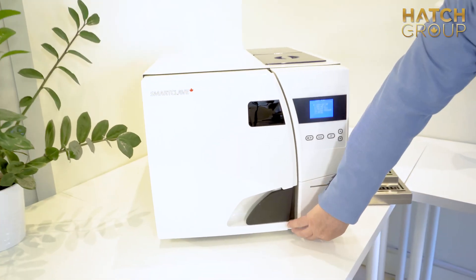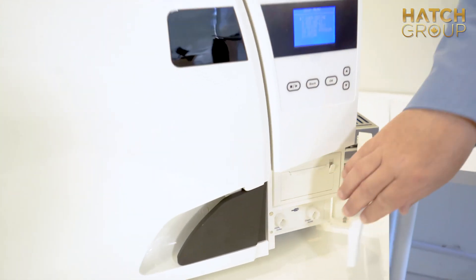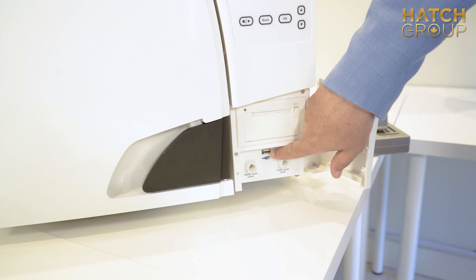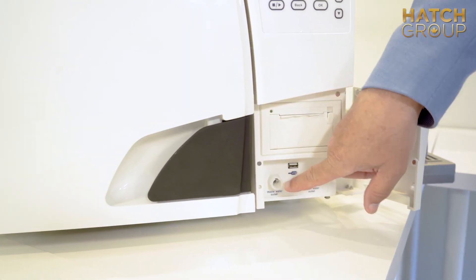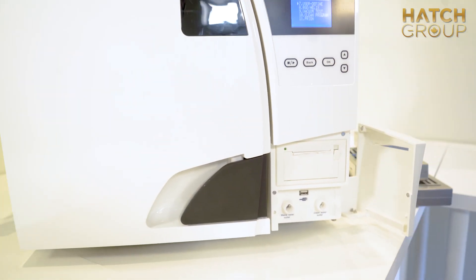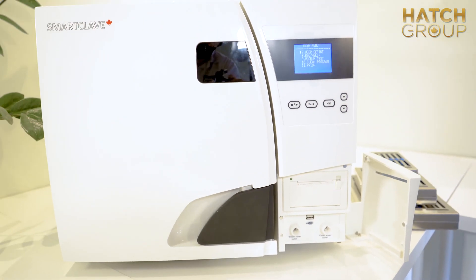Another great feature is it's got a built-in USB and printer. As you can see, you've got the printer here, you've got the USB here, and then you have your waste and clean water right in front — easy access, easy to use.